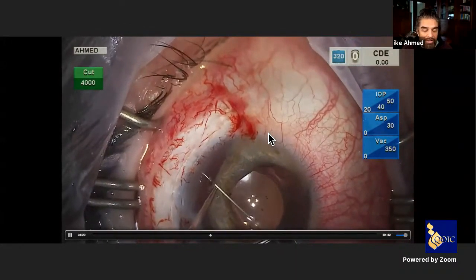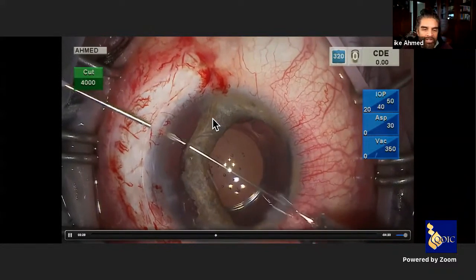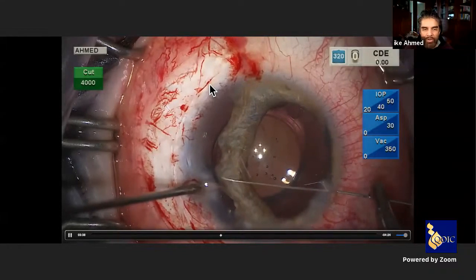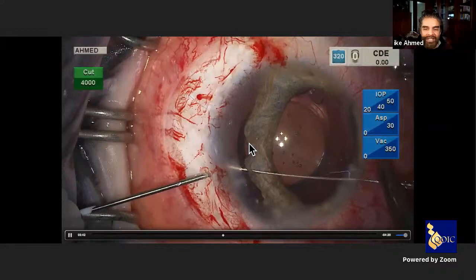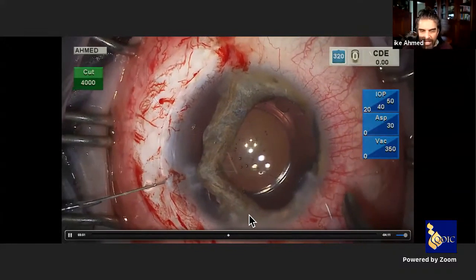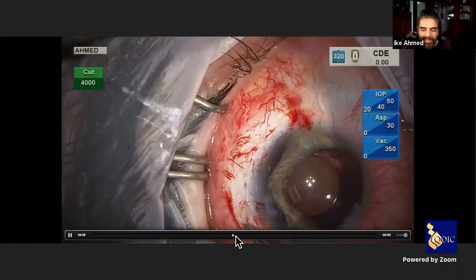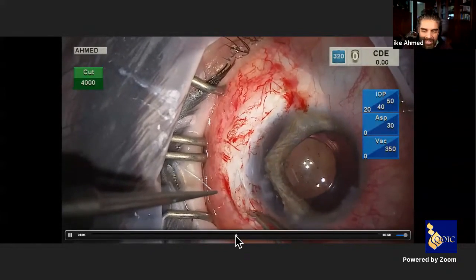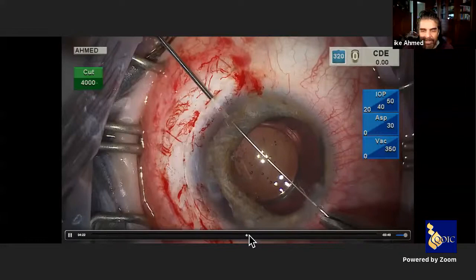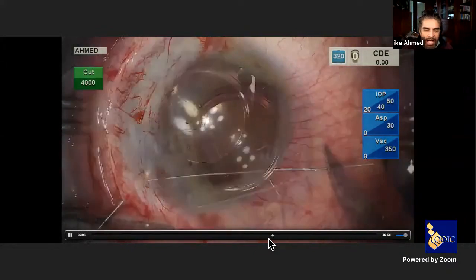There are a variety of approaches including the sewing machine technique; I prefer interrupted mattress sutures. I dock the suture with a 27-gauge needle. Remember: the arc length of the iris is shorter than the arc length on the sclera — so take wider spacing between suture bites going out of the eye than in the eye, allowing the iris to spread over the circumference. I use a slipknot initially to allow titration of tension after placing all suture bites. Multiple mattress sutures are placed across the dialysis to close the defect.